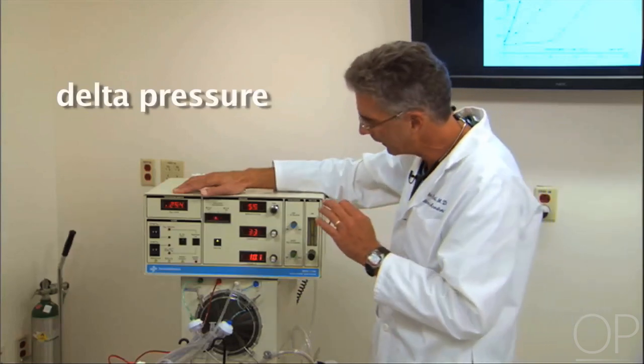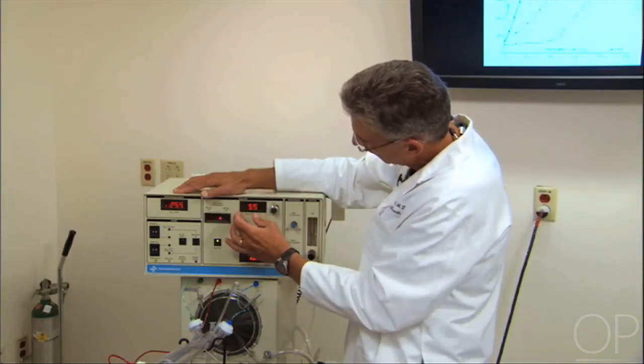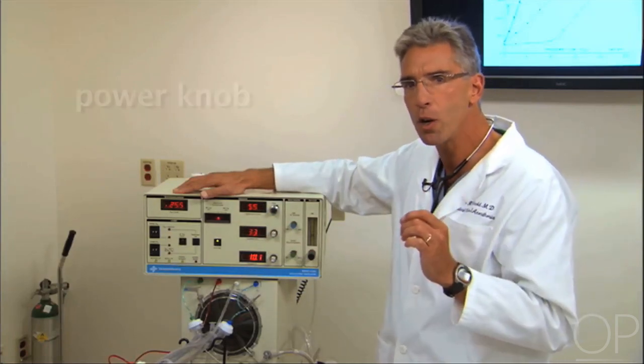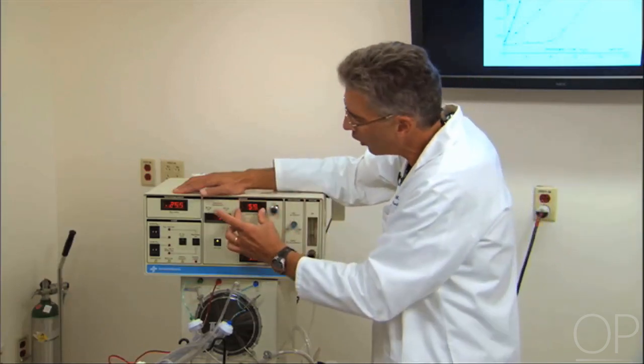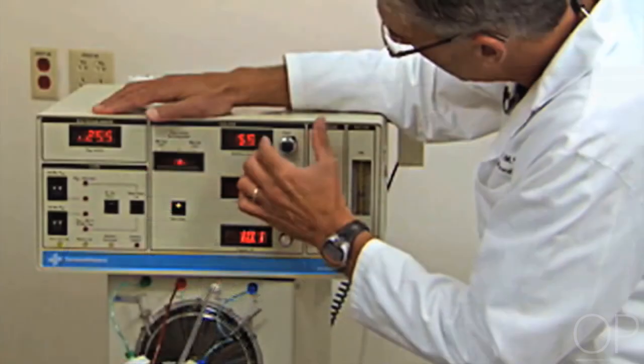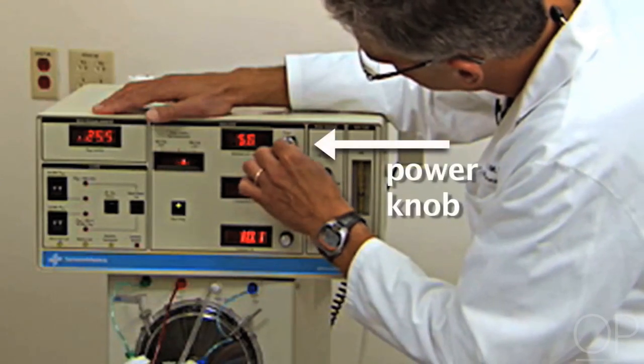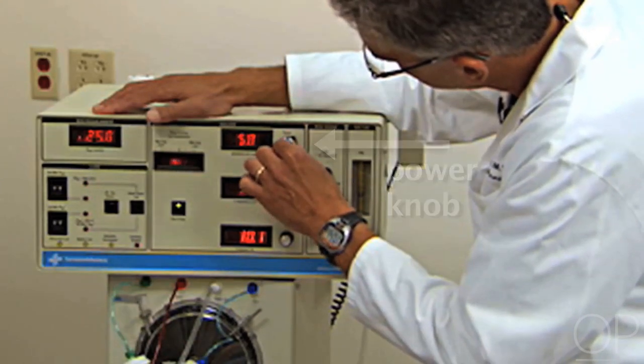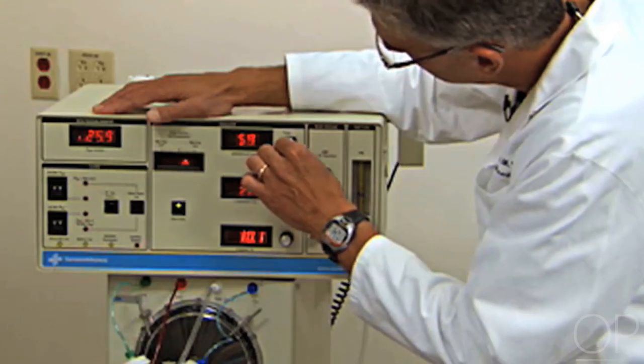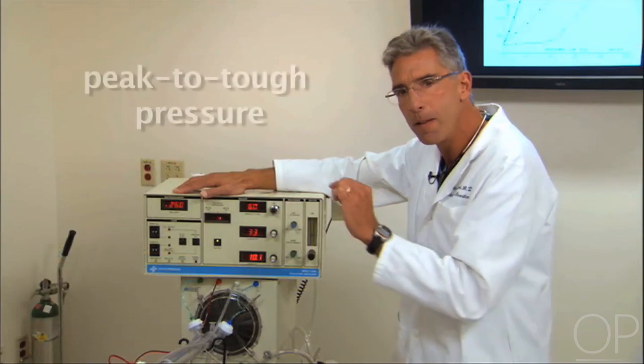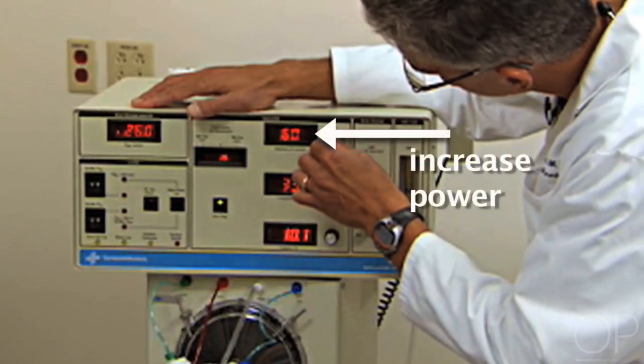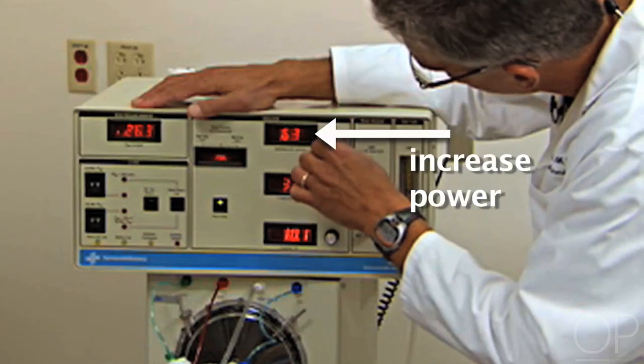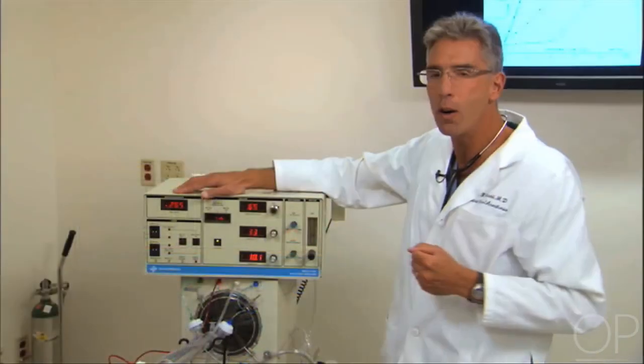Now the delta pressure is displayed here. It turns out we adjust the delta pressure by turning the power knob. So you actually increase power and that generates a higher delta pressure, which is a measured variable. And we increase power simply by turning this knob. So I'm now aiming to increase the delta P to 60 by increasing power. The delta P is the peak to trough pressure, again measured proximally in the ventilator circuit. And to increase it further to 65, we simply increase power in another increment.